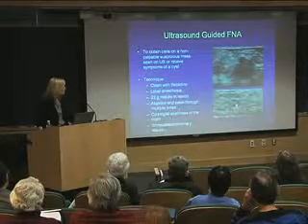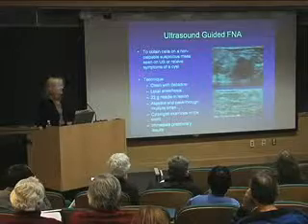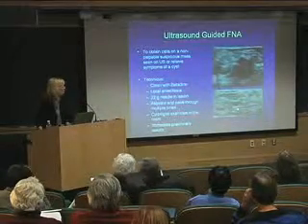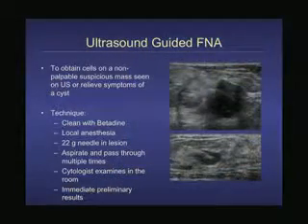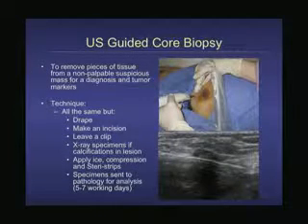Or right here, do you see how I'm just aspirating and this mass is shrinking? That's because I'm taking the fluid out. It turned out to just be a cyst. It didn't look like that, or we would have left it alone, but it looked like maybe it wasn't. And so once we aspirate, we just took the cells out. And the good thing about this is often your pathologist or cytologist is right in the room, and we can give you an answer immediately. It'll be preliminary. It'll still take 5 to 7 days to get the final result, but they can give us an answer right away. Whereas a core biopsy, now that's a little bit more invasive.